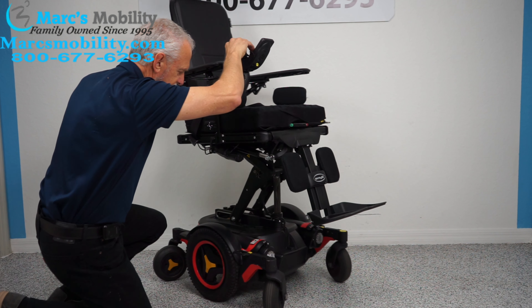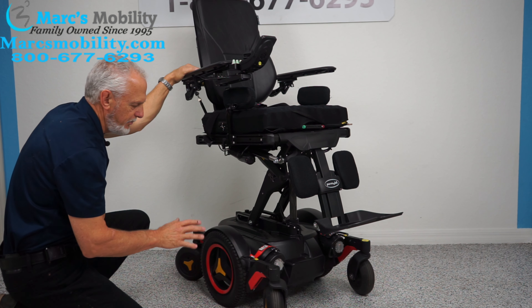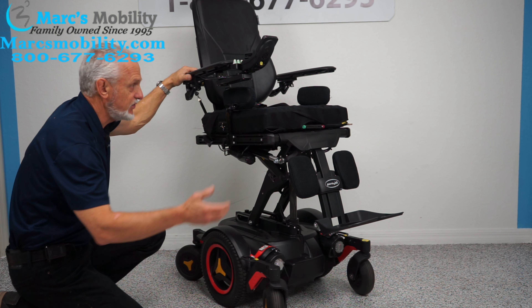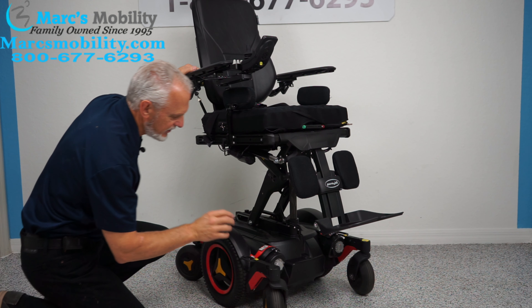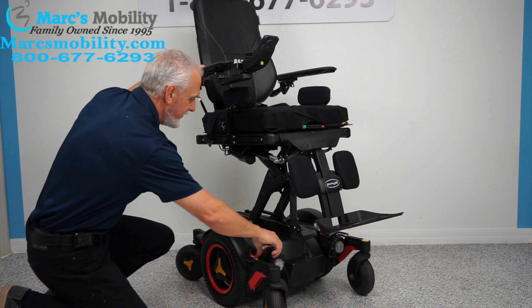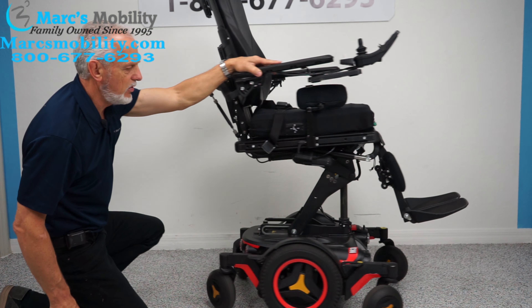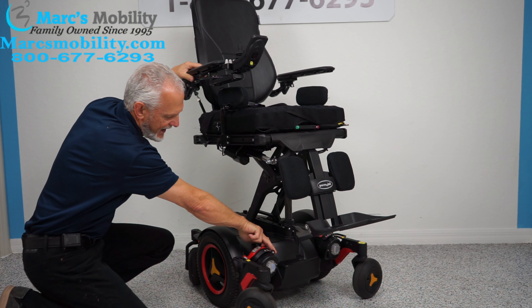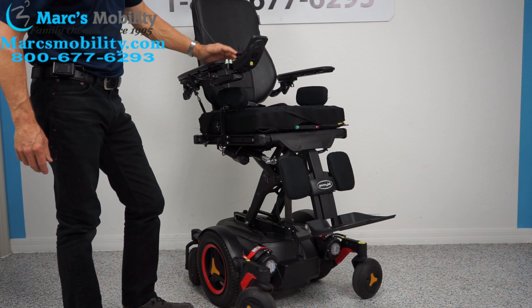The M3 has two motors. If you look at the front you can see the round part — that's the motor going directly to the wheel. This chair weighs about 425 pounds, so it's pretty heavy. If you ever need to roll it manually, turn the power off first so there's no resistance in the motors. On the M3, look at the front of the motor for a small handle — about an inch tall with a little screw. Moving it inward unlocks the wheel. Do both motors, then you can roll the chair. When done, bring the handle back into gear.